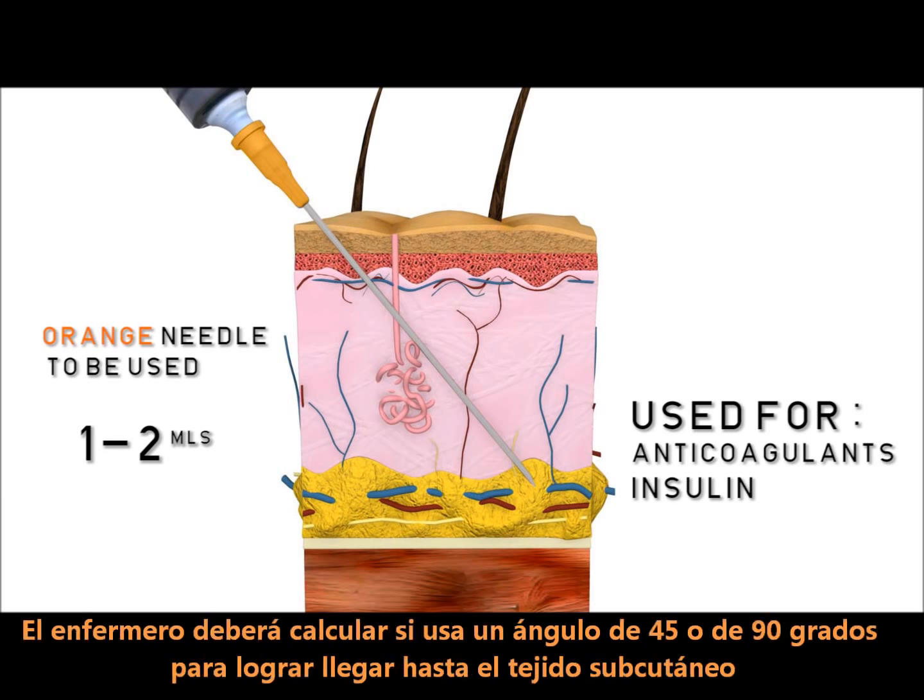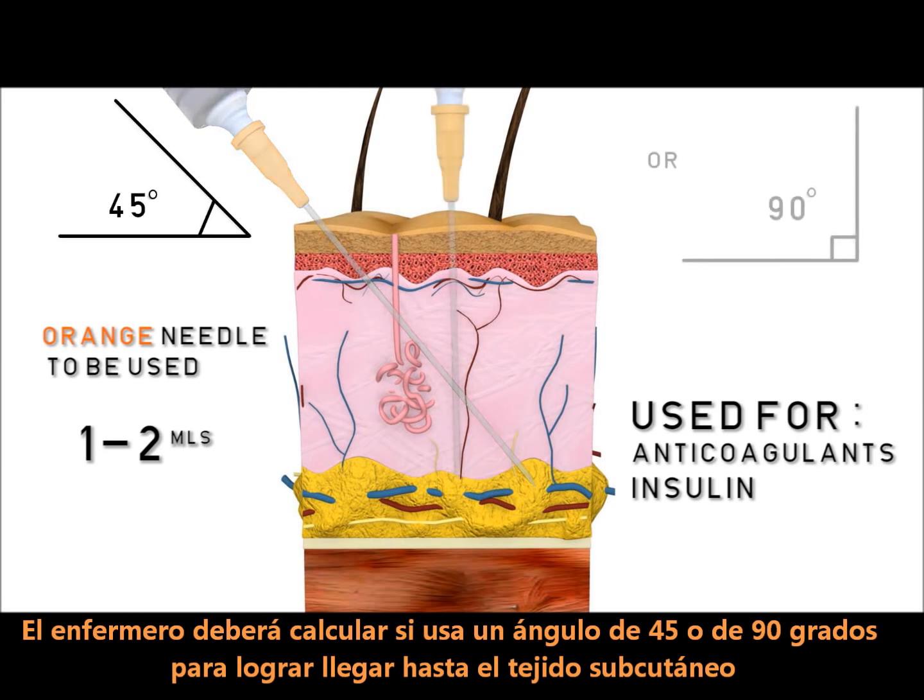The nurse has to calculate whether using a 45 degree angle or a 90 degree angle to reach the subcutaneous site.